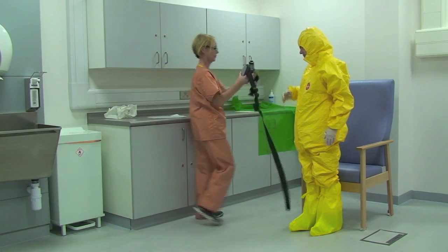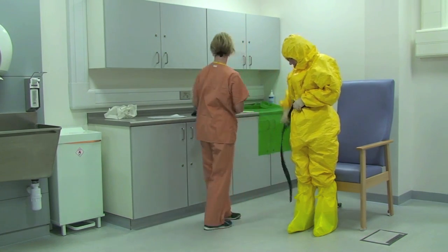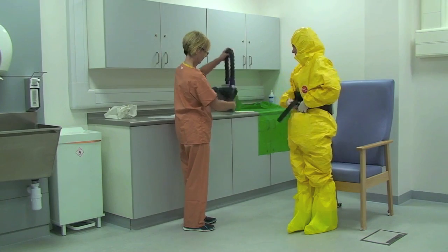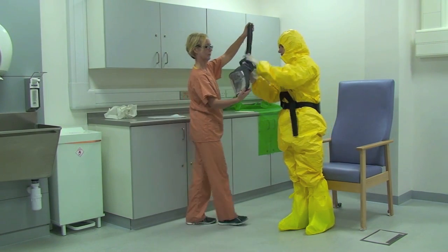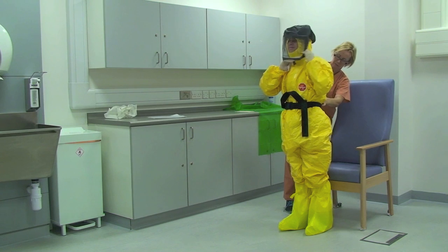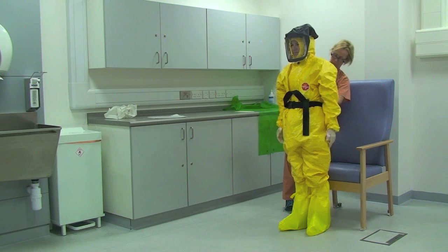The buddy assists the healthcare worker to fit the battery pack for the air fed hood to their waist. The buddy then assists the healthcare worker to fit the air fed hood and hose and turns the respirator on. The hood will then inflate.